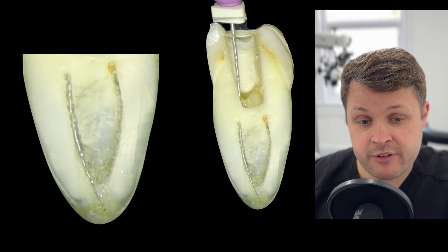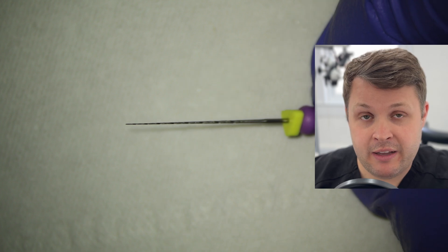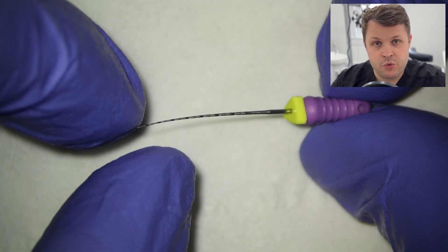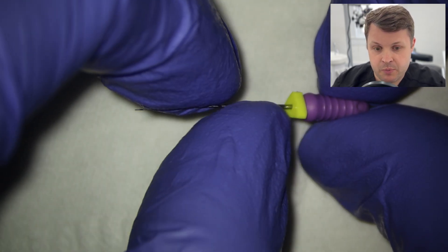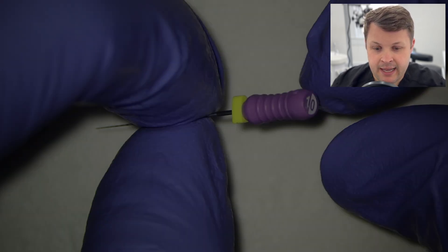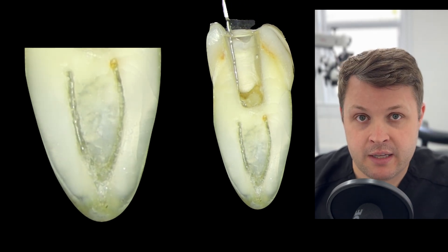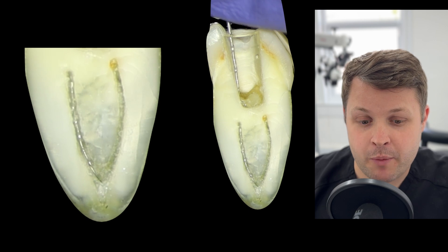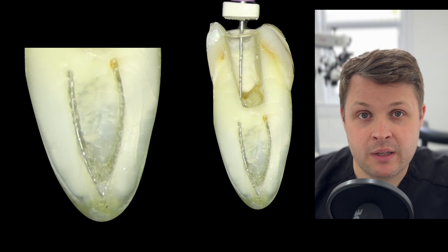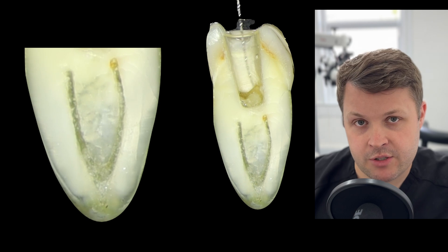My go-to hand file here is a D-finder. If you're not sure what D-finders are, they're like normal hand files but with a very smooth bore shape, and the great thing is they slip into really tight canals easily. In this case, the D-finder isn't progressing to the apex in the buccal canal, and the lingual canal is also getting stuck.